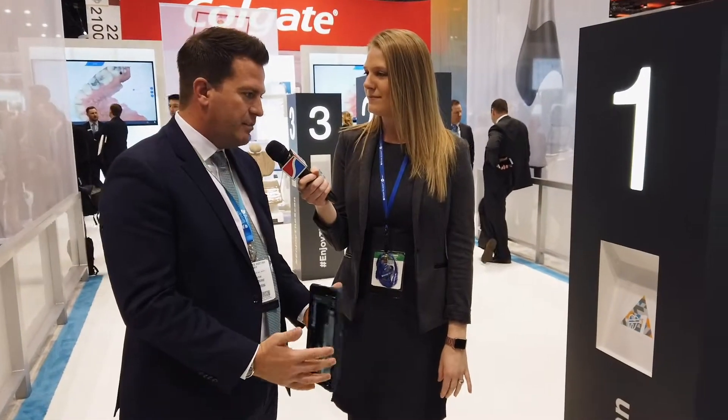Thanks, Chrissy. We're super excited about the launch of PrimeScan here at Chicago Midwinter 2019. Today is our global launch of the product and we're extremely excited to be showing it to the dental community here in the US. PrimeScan is a unit — there's no other digital impression scanner like it in the industry in terms of speed, ease of use, and accuracy.